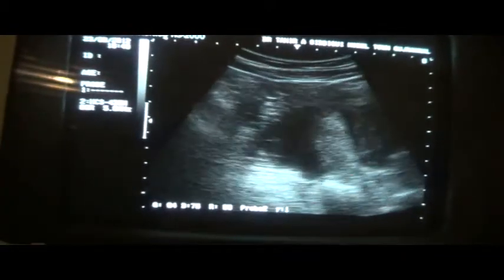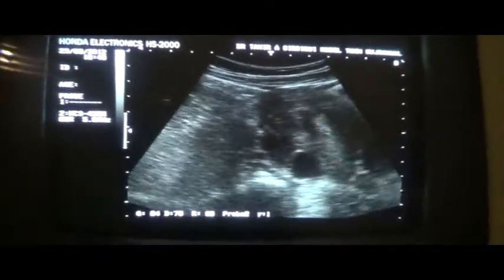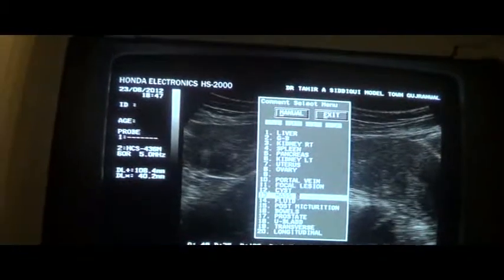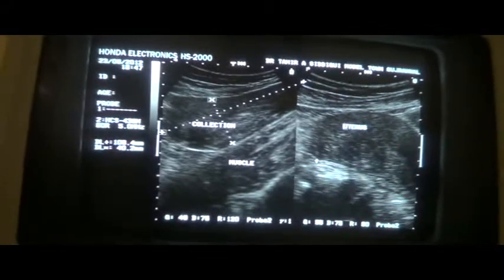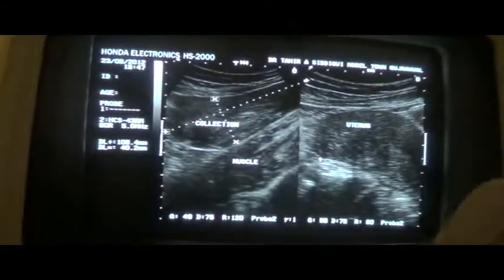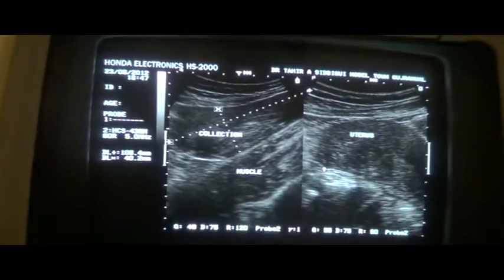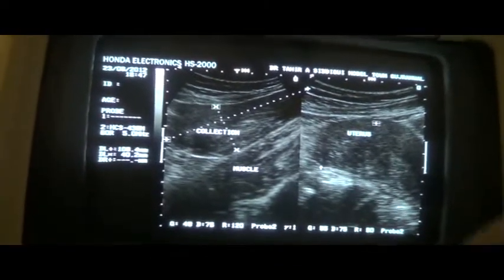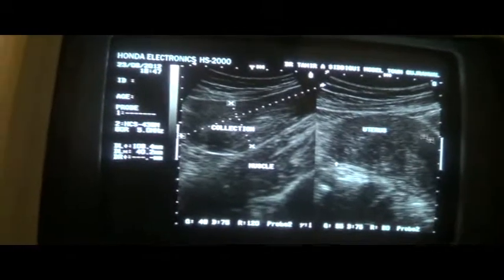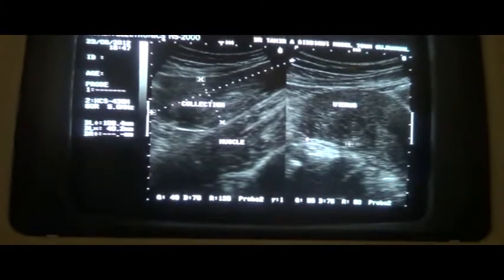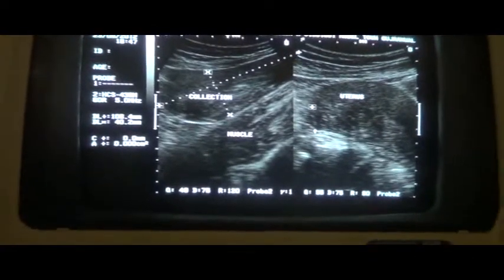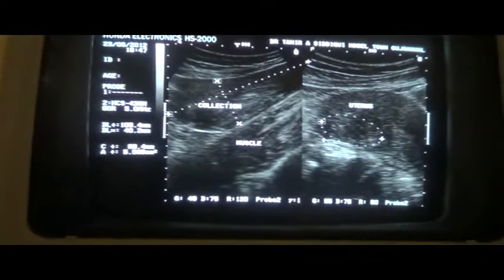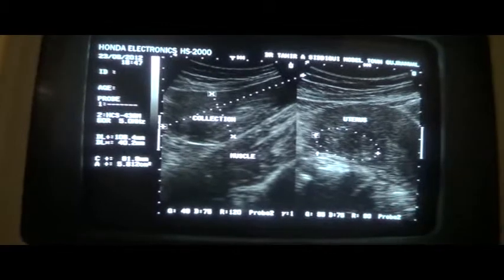Now let's move towards the right adnexa. As I move towards the right adnexa, I do see a cystic area. This is the anterior myometrium, this is the fundal region, this is the posterior wall. The posterior wall is not as smooth as the anterior myometrium. Note the echogenicity and thickness of the anterior myometrium compared to the fundal area — in this region the echogenicity is absolutely different. This encircled area is the area of damage to the uterus, which has possibly healed with time.